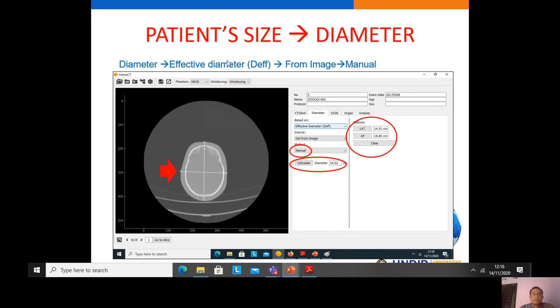The effective diameter can also be calculated from the image of the patient. When calculating from the image, there are two options: manually or automatically. For manual calculation, we draw the diameter in the AP direction and in the lateral direction by clicking the lateral and AP buttons, then calculate to get the effective diameter of the patient from the lateral and AP diameters.